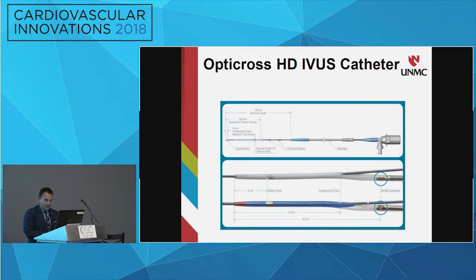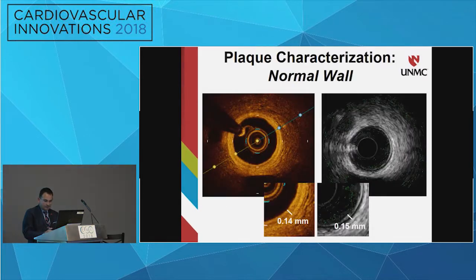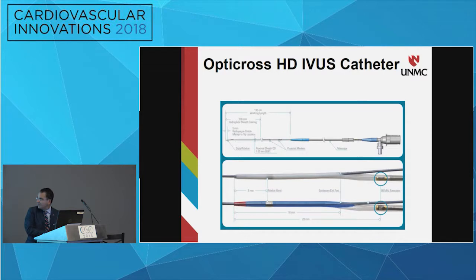This is a rapid exchange catheter, which this mouse doesn't work well here. And I'm trying to, sorry about that. Yeah, so the, you see it's a rapid, oh, beautiful, okay, thank you.